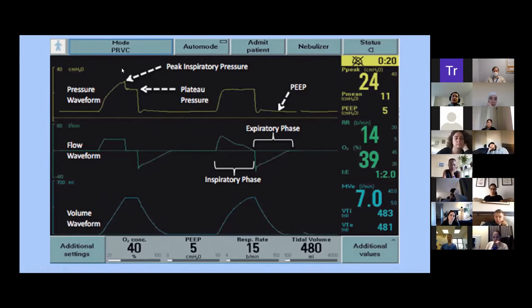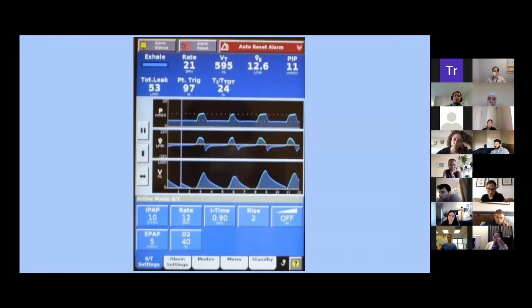You can match the inspiratory cycle with the flow and the volume here, and take into account that the inspiratory phase goes up, then it comes back to 0 when it reaches the maximum inspiratory volume, and then when you start exhaling, it drops down here and then returns to 0. And it's very important that it returns to 0, guys. You always have to see the expiratory flow returning to 0. If you don't see that, the patient is breath stacking and you're doing something wrong.